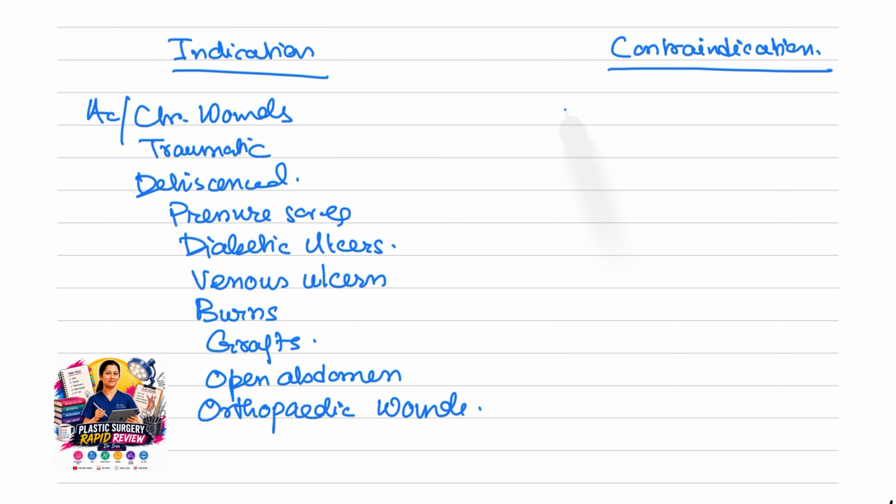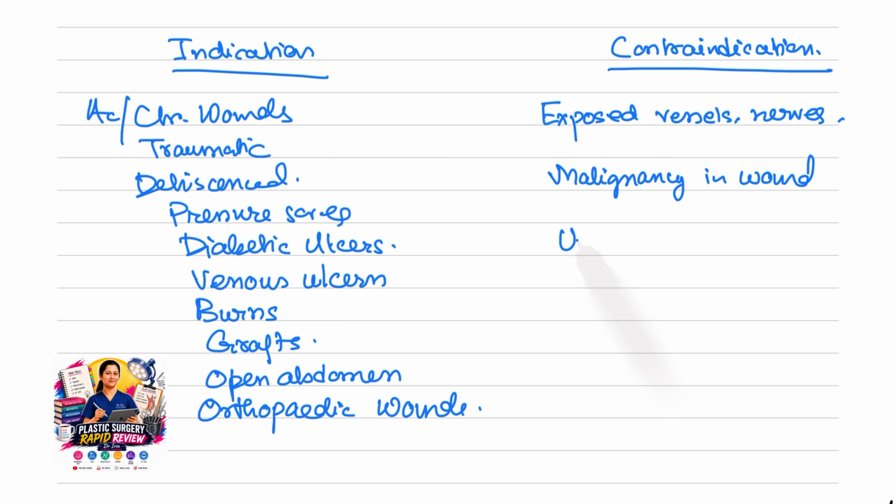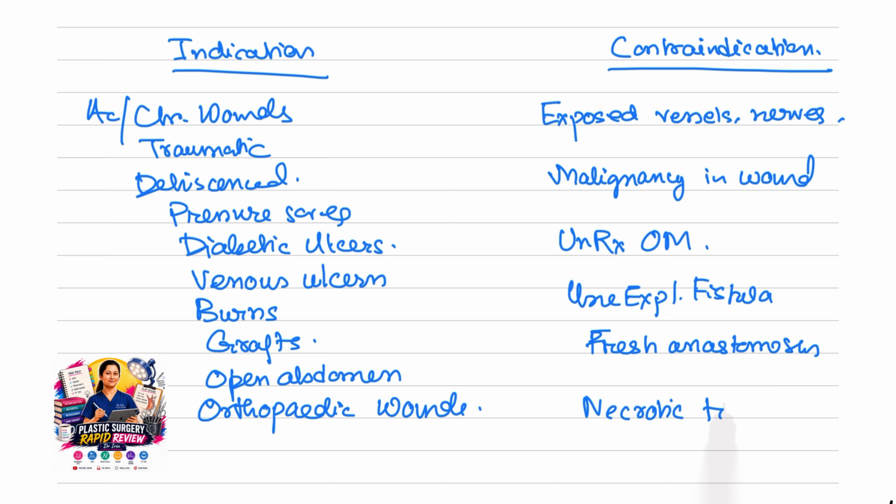It is contraindicated in cases of wounds with exposed vessels, nerves, malignancies in wound, untreated osteomyelitis, unexplored fistulas, fresh anastomosis, and necrotic tissue with eschars.